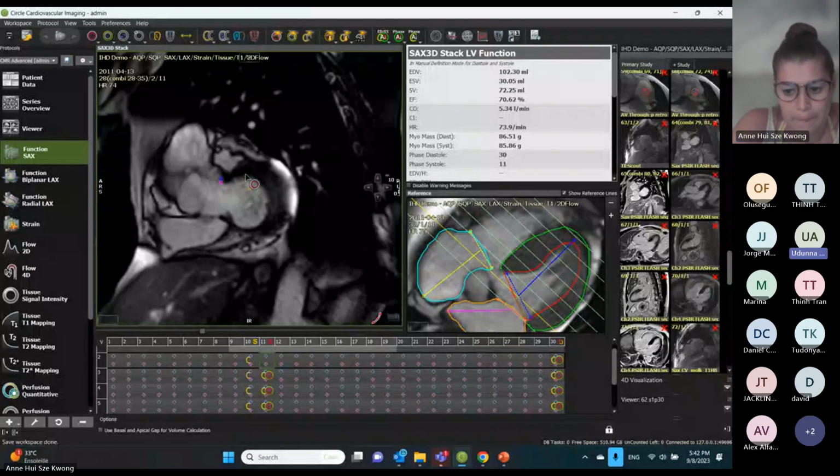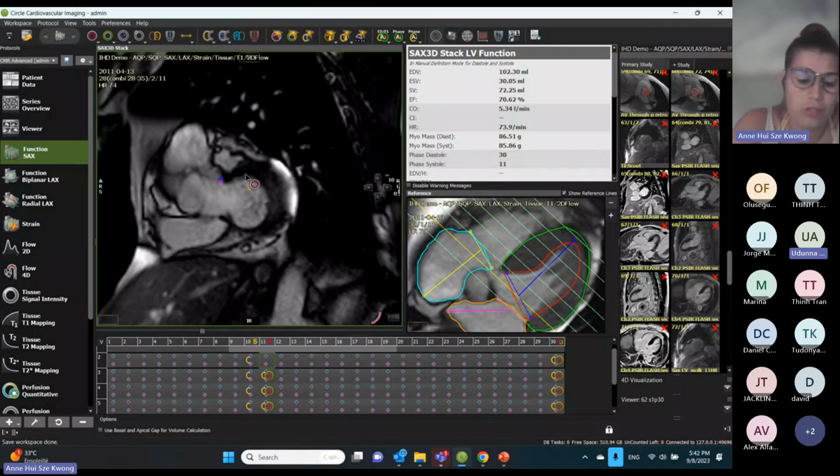Right. No, okay, this is good. This is fantastic. I guess the trial license they get and the student license you get, will they include these features, at least for them to try out some of this stuff?